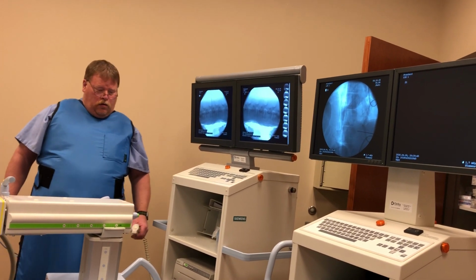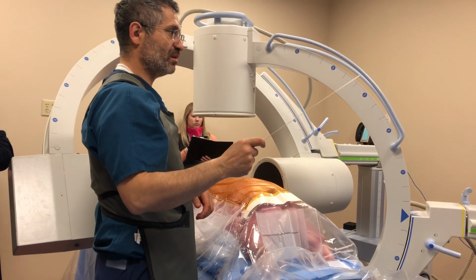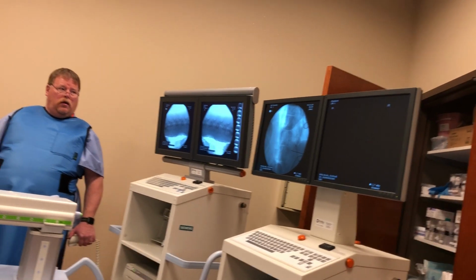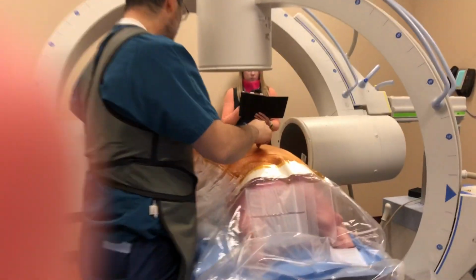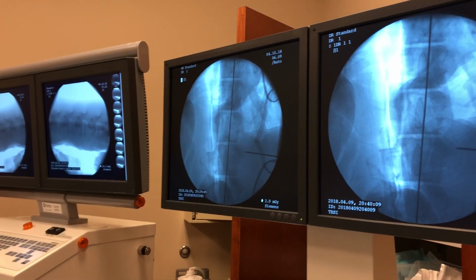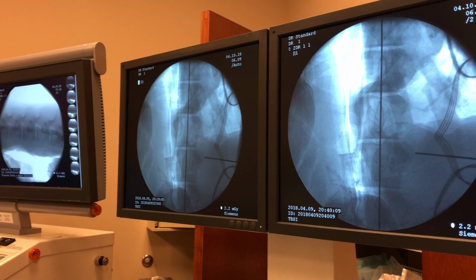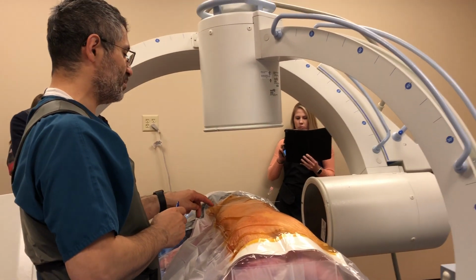So, the first step after this is again to identify the actual midline. The spinous process should be exactly centered, which it is, I believe, here. And then it doesn't matter how it feels or looks, I always confirm that. Get the AP. And I mark it. And then I mark the trajectory of the end plate in the AP.